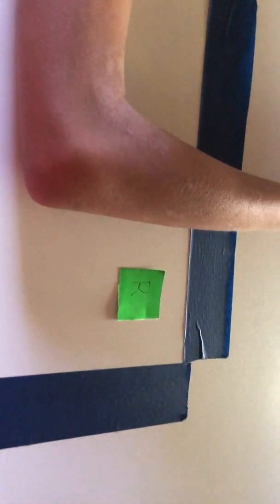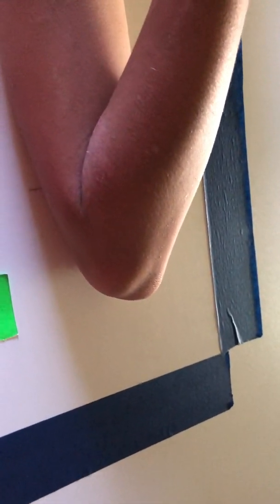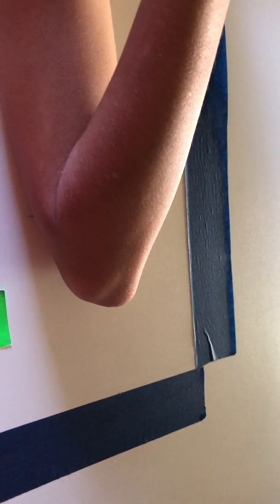For special views, we will do the Jones. The patient will flex their elbow, placing it on their shoulder, and we would push a little bit more up this way. It's supposed to be about 2 inches. It's kind of hard, but I'm just trying to get 2 inches superior to the olecranon process. What I am looking for is that the forearm and humerus should be superimposed with no rotation. The olecranon process and soft tissue of the distal humerus should be visualized. This is again 10 by 12 film, 40 inches SID.